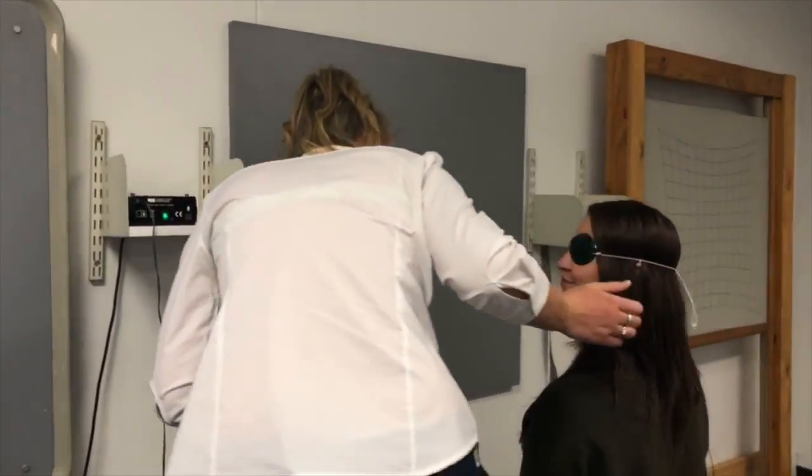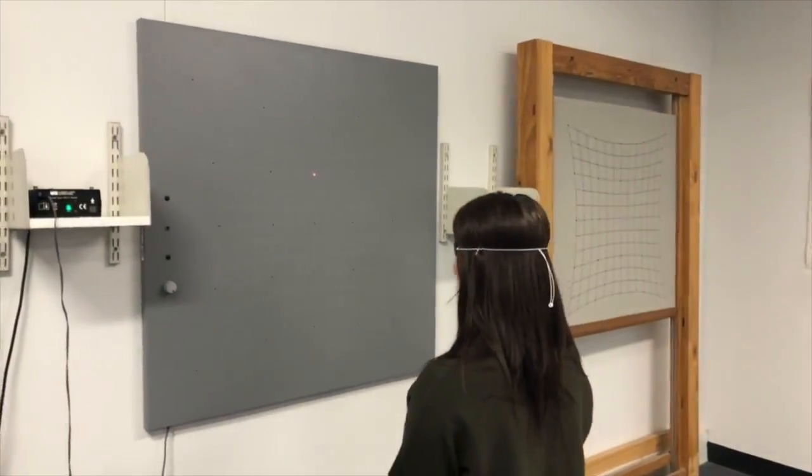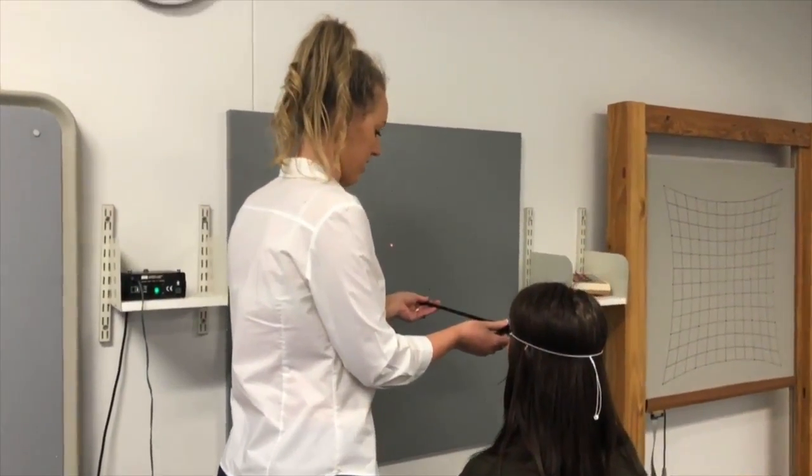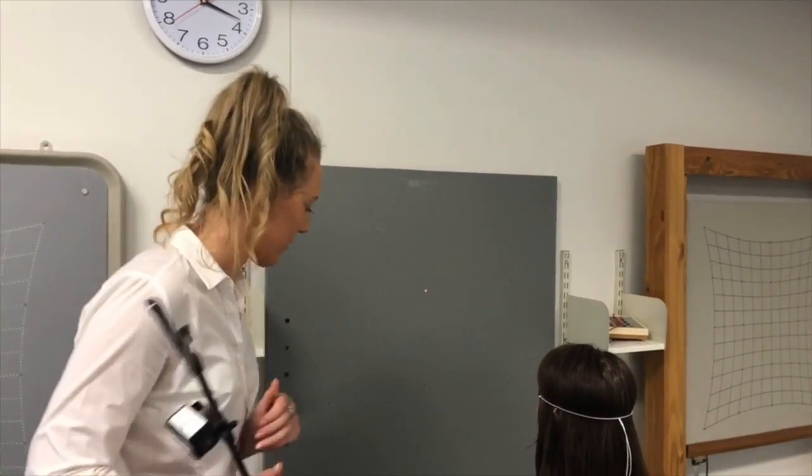Beautiful. Now that's not pressing in anywhere. Nice and comfy. Perfect. And again, we're just going to measure, just make sure we're at the right distance. Beautiful. Now I'm just going to go turn the lights off.